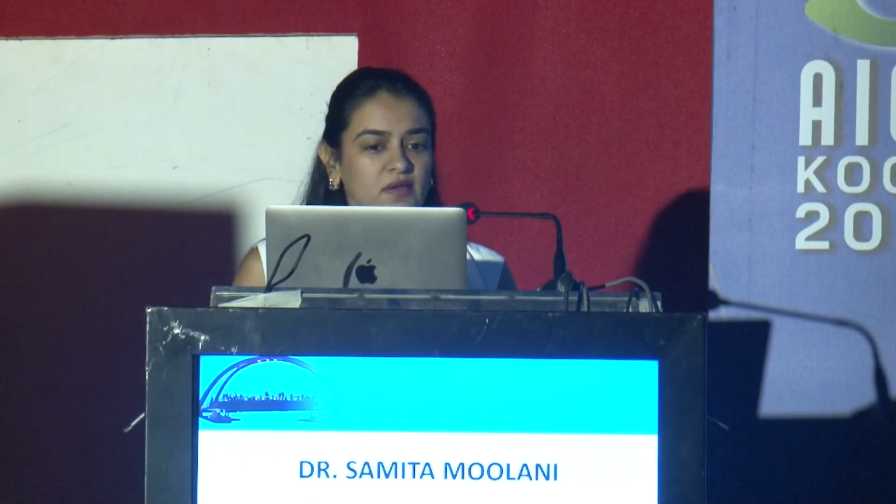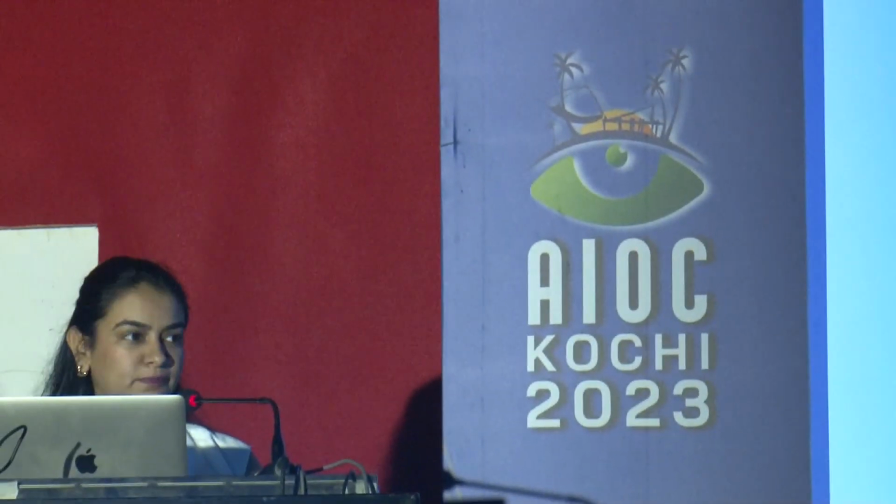Toric lenses you put only if the astigmatism is more central and more balanced over the cornea. If you see decentered corneas, I would not recommend it. And basically, if you just position your incision right, most times you should be fine.